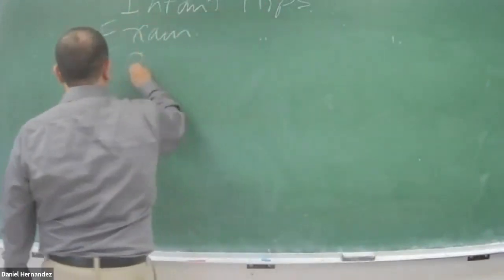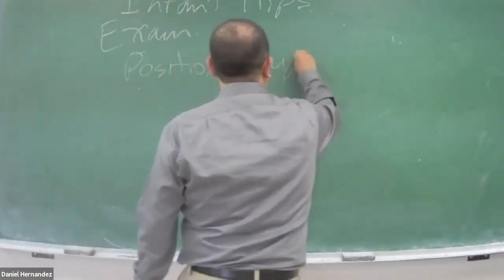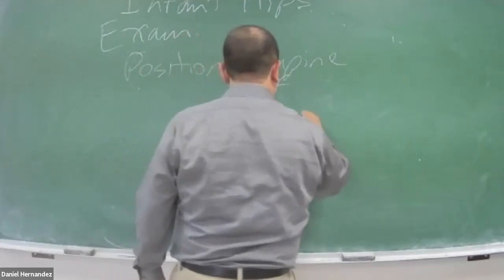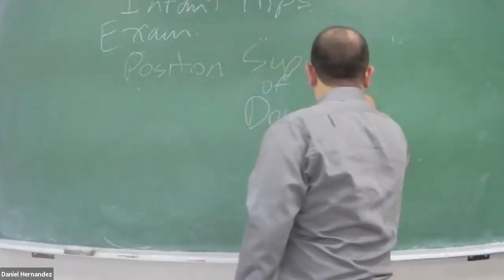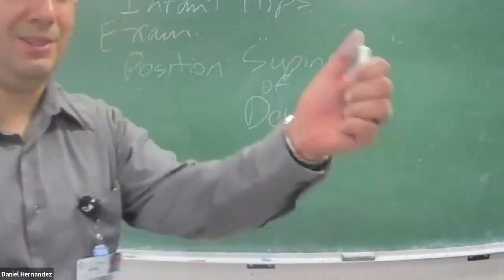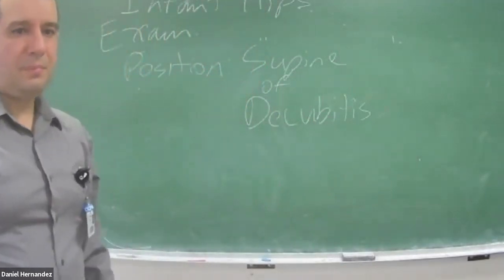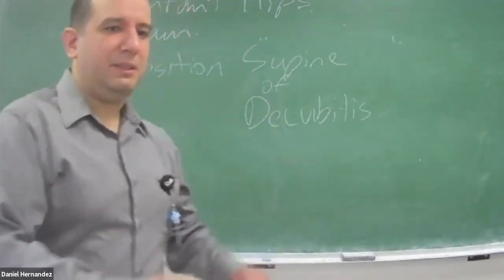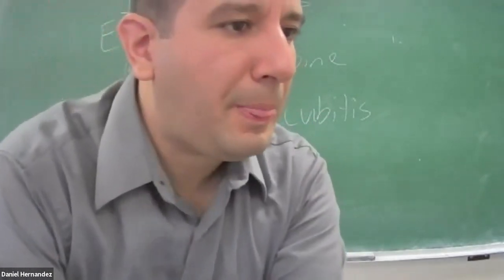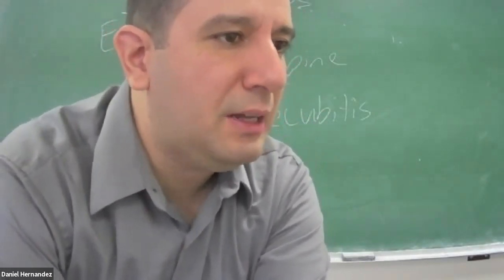So position. Supine. I prefer supine. For me, it's just easier. Decubitus view. You can roll some towels up underneath the baby's back to keep them turned. There are specialized cradles that may also help keep the child on the side.